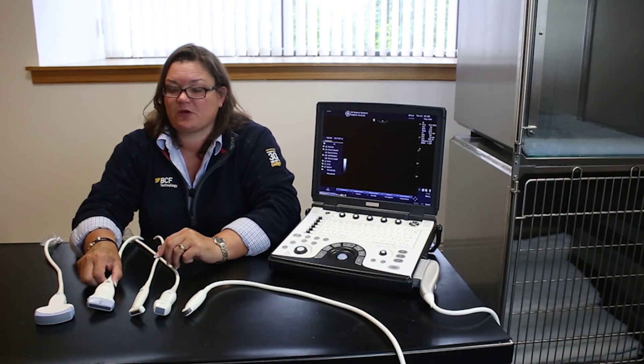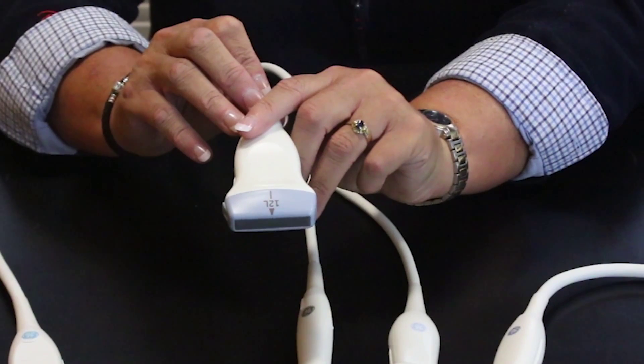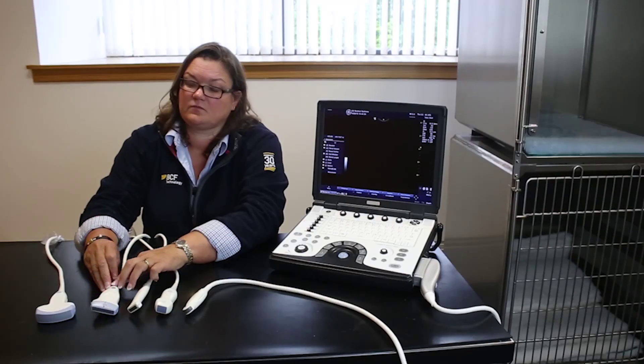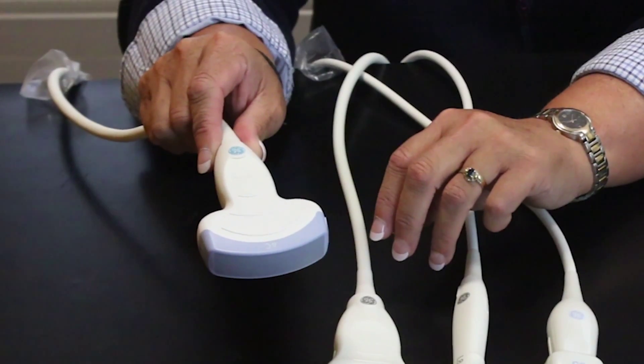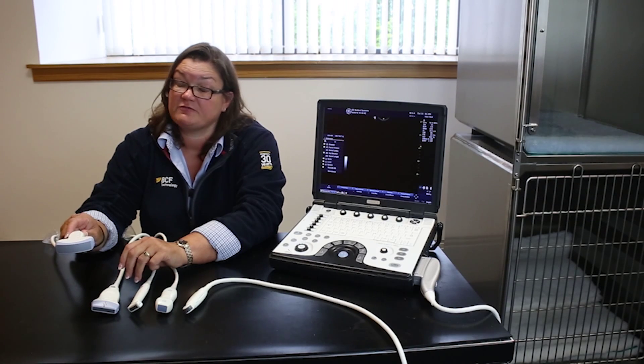Back to equine practice, for your tendon scanning there's the 12l probe, used with or without a standoff. And then the 4c is a convex probe with lower frequency, very useful for equine abdomen work or even giant breed dogs.